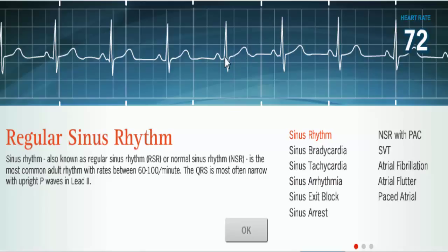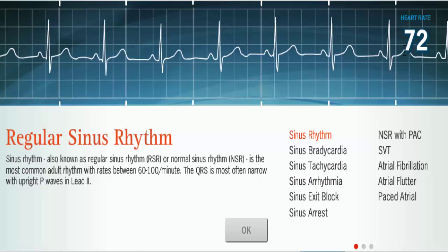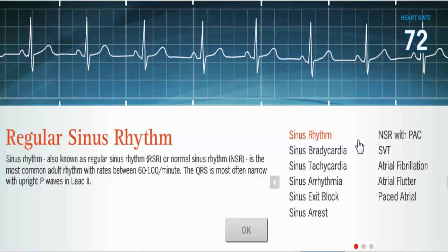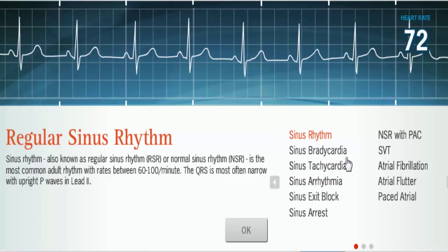With atrial arrhythmias, we're going to see changes with our P wave, because the P wave tells us where the beat is originating in the atria. Here we have sinus rhythm with a heart rate of 72 — just basic normal sinus rhythm.